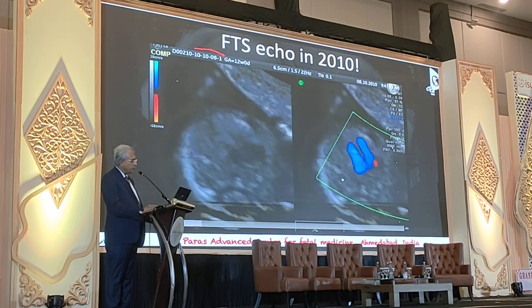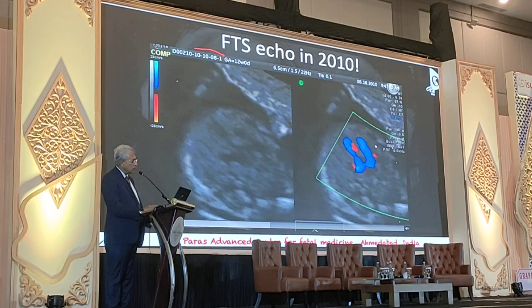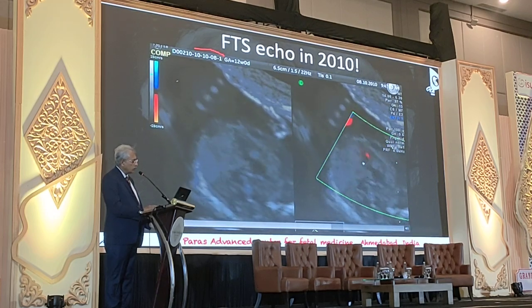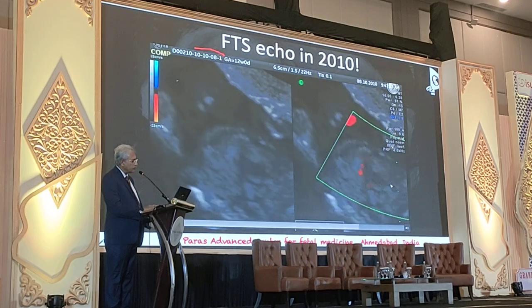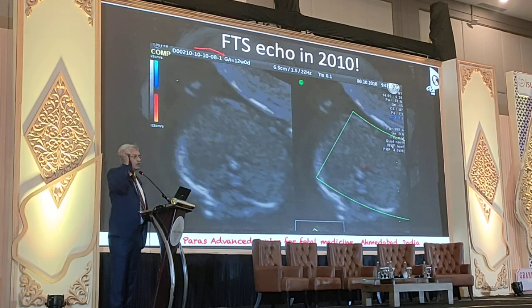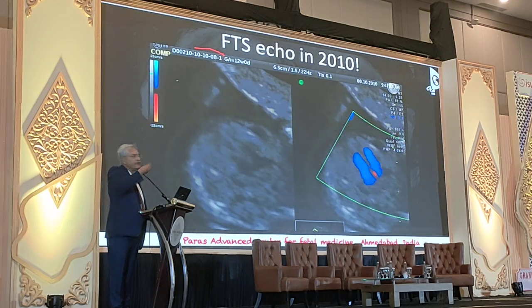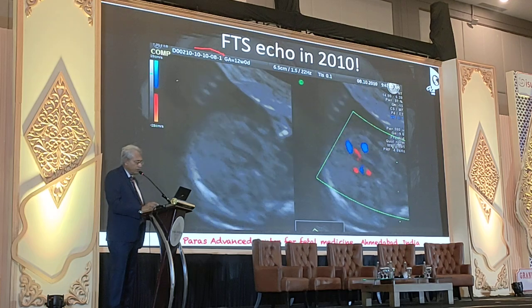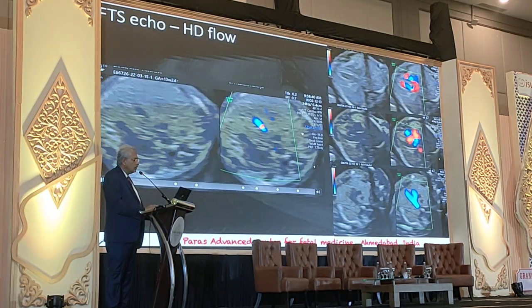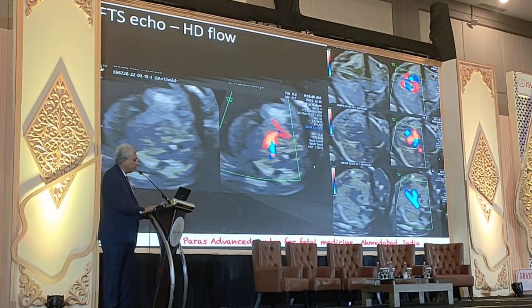I have put it half by half. You can see the interventricular septum is good. Both chambers are filling. You can see both vessels are crossing. Then you have 2 major outflow tracts which are fine, and it is the formation of a V. A 15-year-old clip I am showing you just for the sake of reference. I know that your machines are far better than the 15-year-old technology today. So you should be able to identify all of them, and all of these things can be seen: 4-chamber view, interventricular septum, crossing, tracheal V formation, and all.